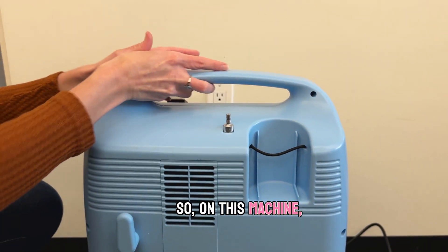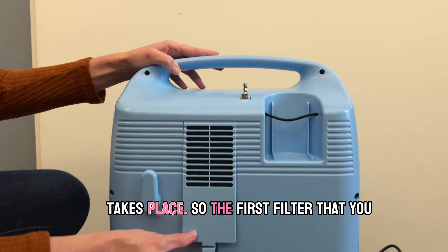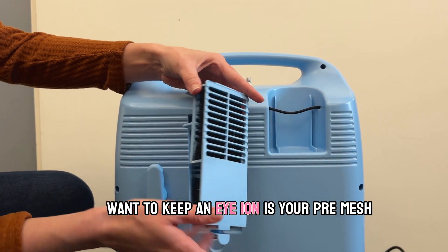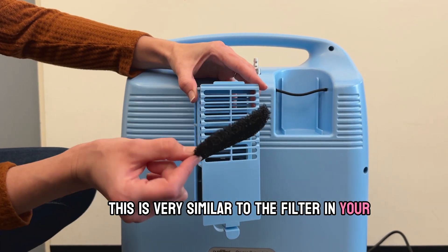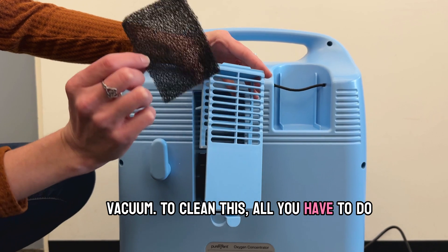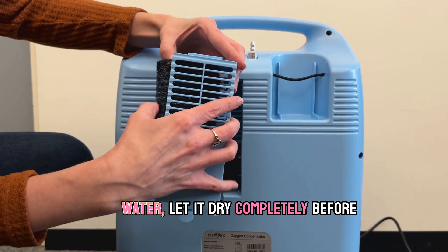On this machine the backside is where all the filtration takes place. The first filter you want to keep an eye on is your pre-mesh filter — this is very similar to the filter in your vacuum. To clean this all you have to do is rinse it off with light detergent and water, and let it dry completely before replacing it.